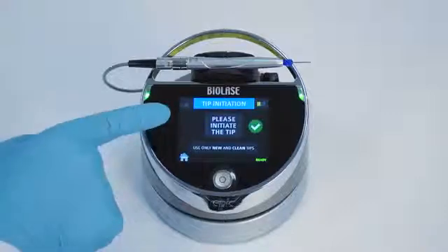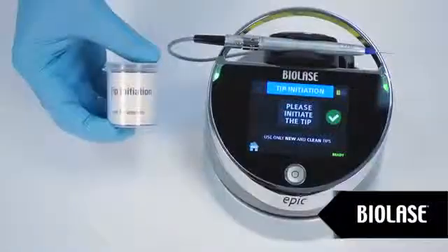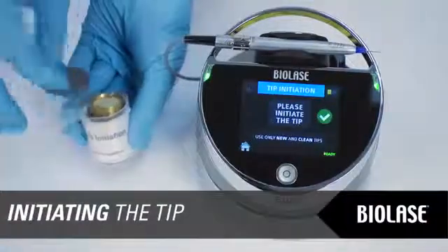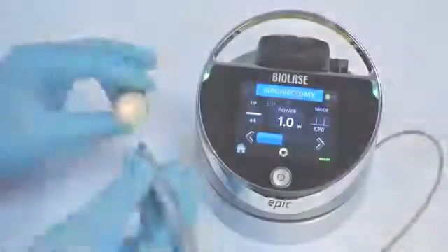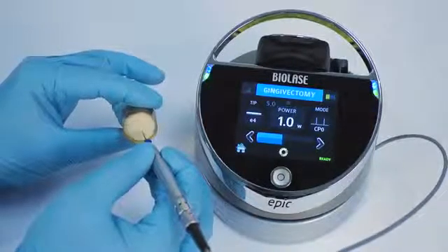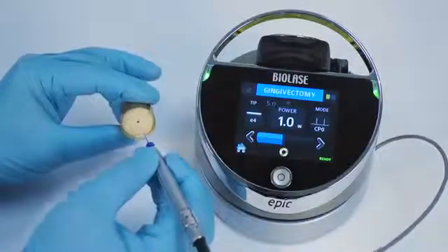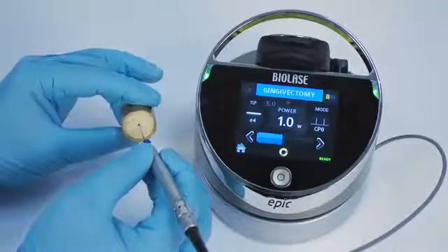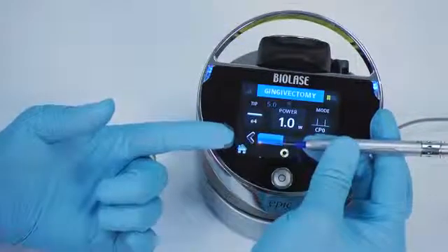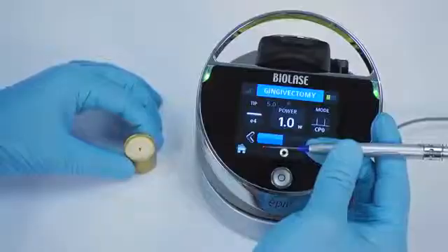Most soft tissue surgical procedures require initiation of the fiber tip. EPIC will prompt you if initiation is recommended. If prompted, follow these steps: open your tip initiation kit and remove the initiation block, which is a small cork. Touch the EPIC tip to the surface of your initiation block without firing the laser. Next, fire the laser, allowing the tip to sink into the block — count 1, 2, 3. Pull the tip out of the block, count 1, 2, and stop firing. At this time, the tip should be out of the block. Fire the laser quickly at a non-reflective surface once. The tip should glow yellow-orange. During a procedure, there is a chance that the tip might lose its initiation, so repeat the tip initiation procedure if necessary.